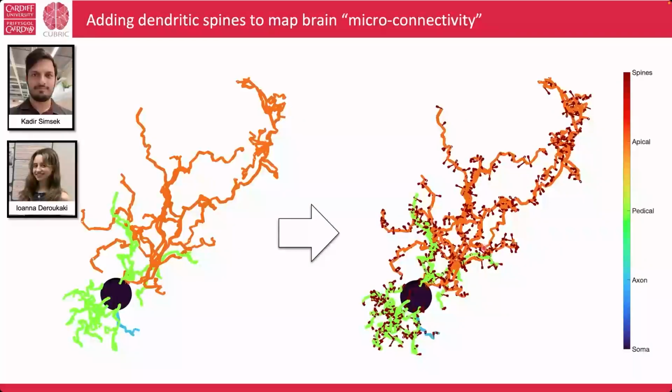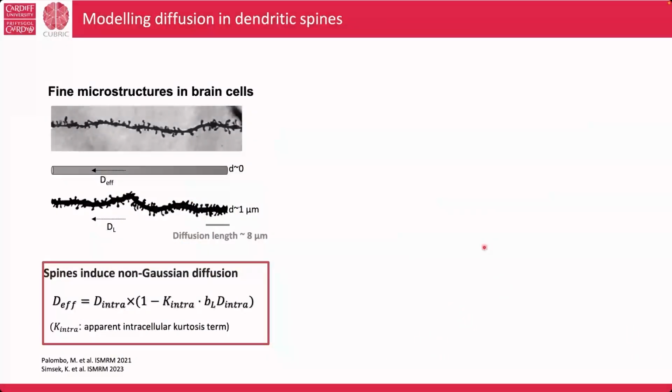So we started with simulations to show if our hypothesis was right. And the short answer is yes, it's right, you can. And then we started working towards how to optimize the acquisition to measure spine density. And so here it was the preliminary work.